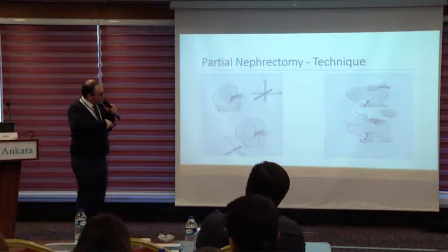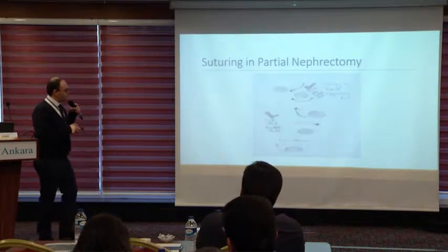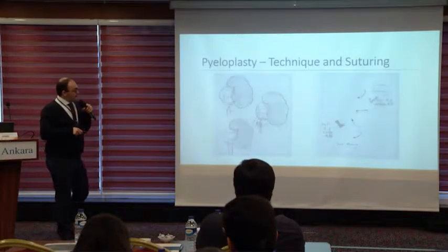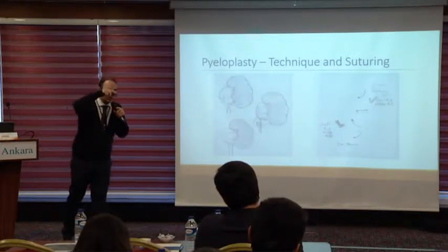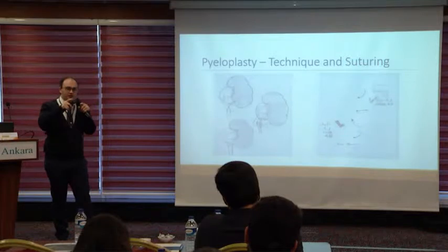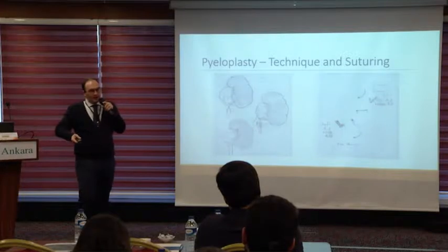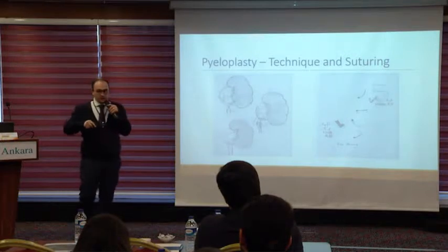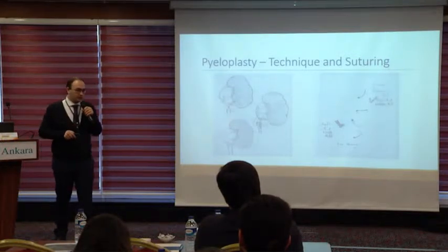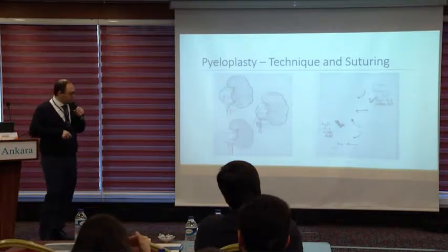Then this Z-axis movement will forward my suture on the linear suture line. If we take a look at the pyeloplasty, which is a circular incision closed in a circular fashion, I always fail. I could never make a complete circular suture with pure laparoscopy, but my mentors, who are very experienced in the robotic system, make these sutures very well. That's why I refer my patients to them.